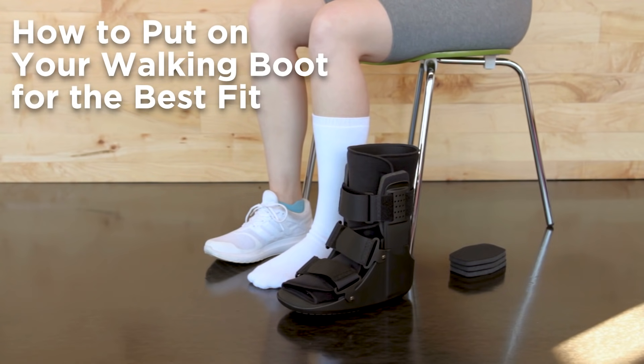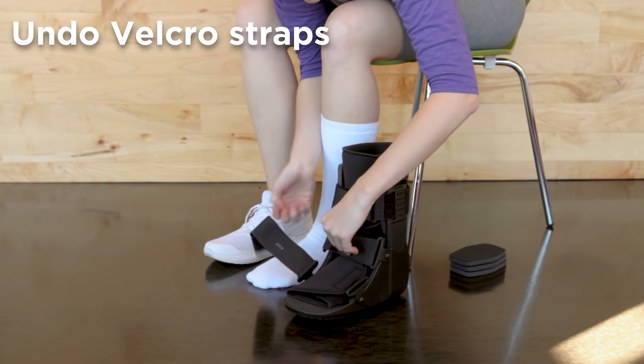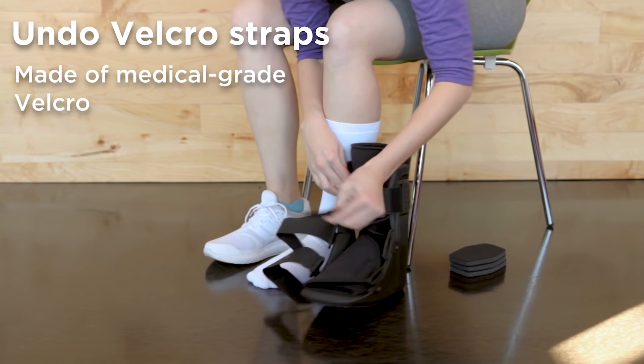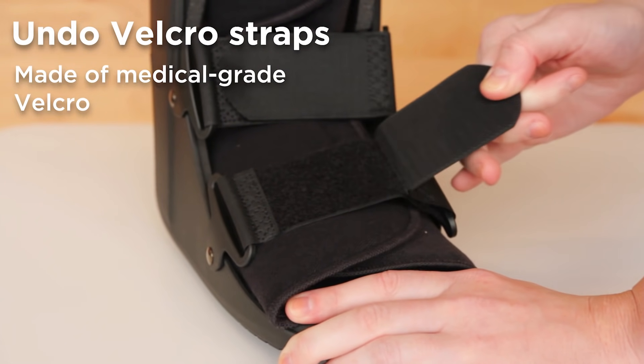Today we're going to cover how to apply your short walking boot to get the best fit. First, begin by undoing all the velcro straps. As you are undoing the straps, you will probably notice the velcro seems really strong. That's because it's medical grade velcro, which is made to open and close more than 900 times.